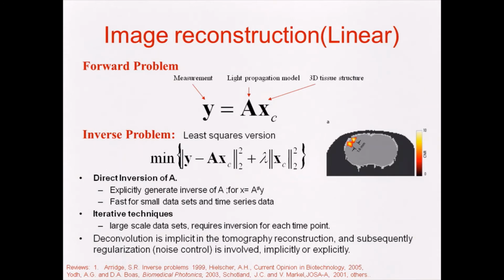And so this is just a recap of all of that. Again, we have a forward model, which is basically a matrix which will map from tissue structure to measurements. And then we have to invert the problem. Another way, conceptually, to think about this inversion problem is that it's a fitting procedure. We are going to fit by minimizing the error between our measurements and some model that we have, and the parameters in the fit are all the voxel values.